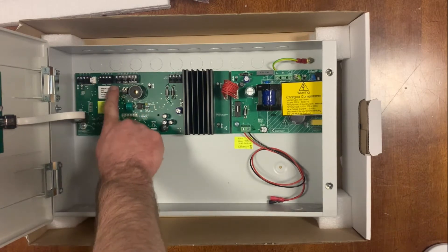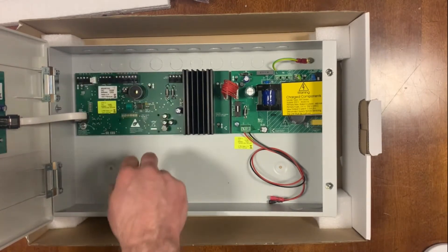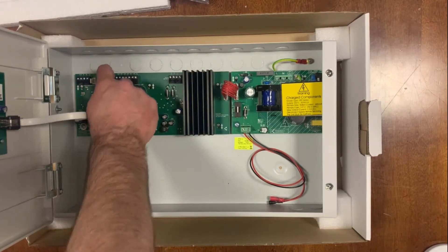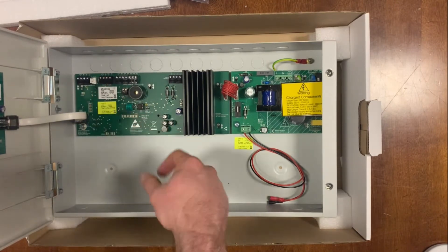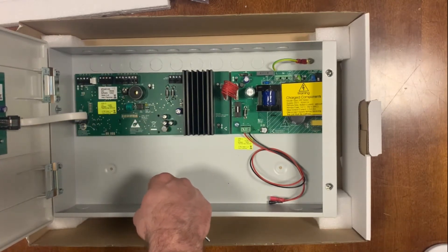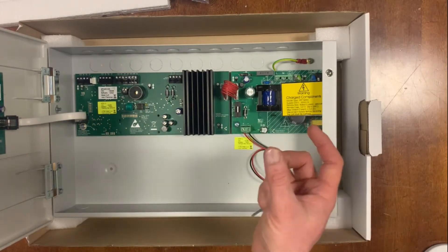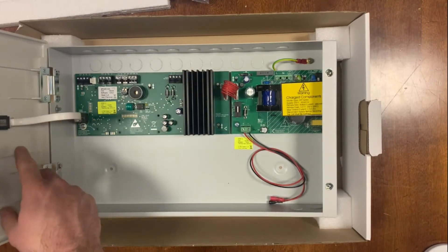The comms ports here are for connecting to a PC if you're using the surveyor software to track calls and incidents on your system, and the other one is out to your pager or printer if used. Pagers are a popular product if you have areas with reduced numbers of staff in a bigger area — staff can carry a pager rather than having to return to the nurse station to see where things have indicated.